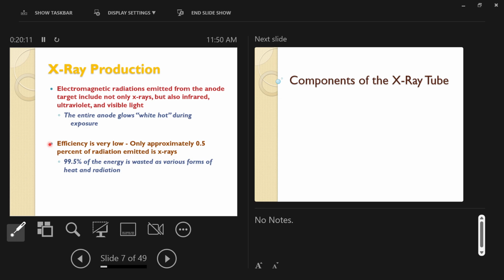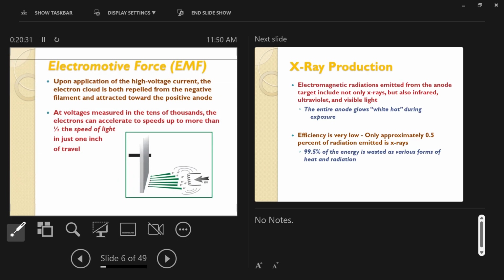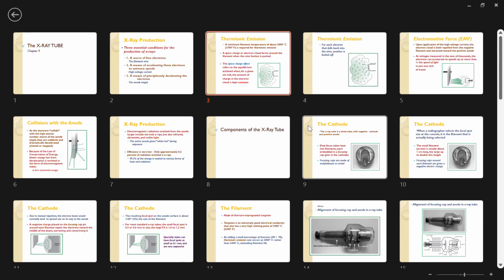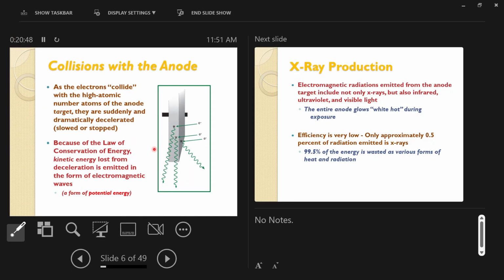Notice the cracks in it, notice the pitting in here. All of that is coming from the, you can grab the rotor face too, like the actual disc too, just don't grab the bottom. All of that has come from the long time use of this equipment, and sometimes it's just normal wear and tear, but other times it's improper use because of the amounts of heat we're making. You know, if you look back to this first couple of notes here, we're creating 3,700 degrees Fahrenheit of temperature in the electron cloud, okay? All of that is going to the anode disk and heating up the disk. Alright, so X-rays come out of the anode disk after we smash electrons into it.